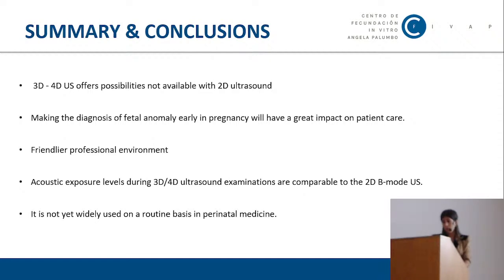Acoustic exposure levels during 3D/4D ultrasound examination, as expressed by the thermal index, are comparable to the 2D mode ultrasound due to the fact that most of the diagnostic information is received from stored volumes. The entire acoustic exposure is even less intrusive than in 2D ultrasound. And 3D ultrasound has been shown to be a problem-solving tool in selected circumstances and may well become a part of many obstetric ultrasound examinations in the future. However, it is not yet widely used on a routine basis in perinatal medicine.